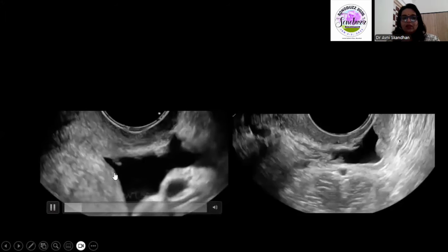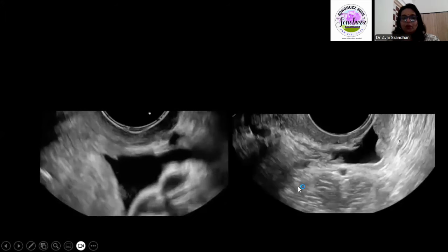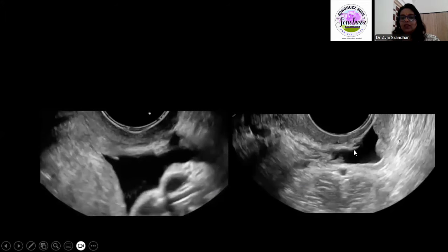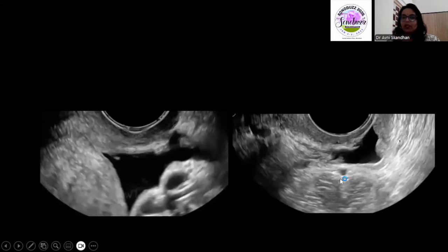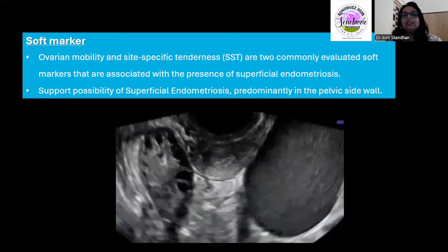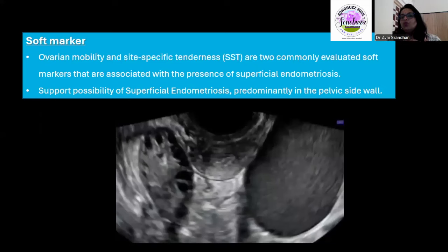Here you can see a fleck moving on pressure — that is a deposit of superficial endometriosis, and this similarly is a superficial endometriotic deposit. There are also certain soft markers: ovarian mobility and site-specific tenderness. These two findings help us; even if we don't see deposits, they suggest there may be superficial endometriotic deposits, especially pelvic sidewall deposits.